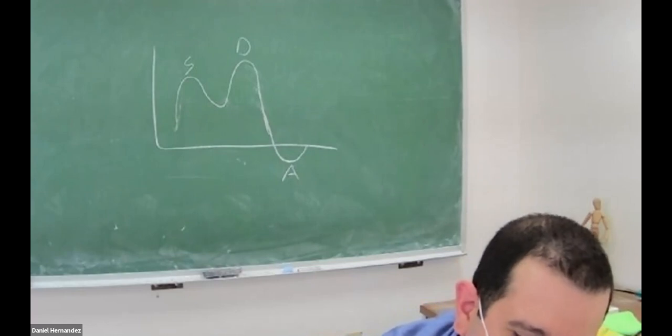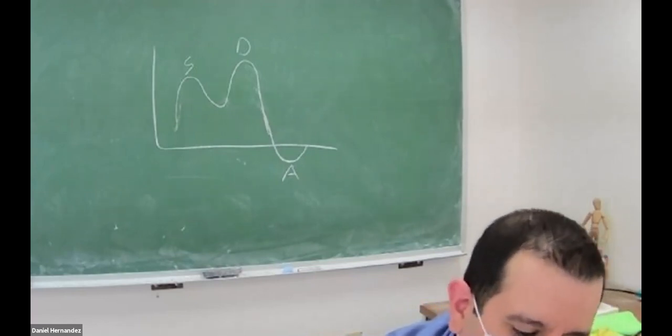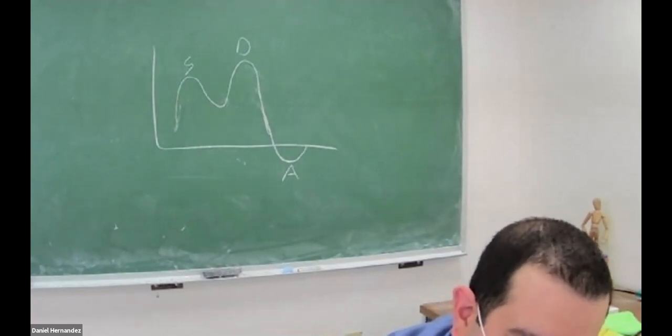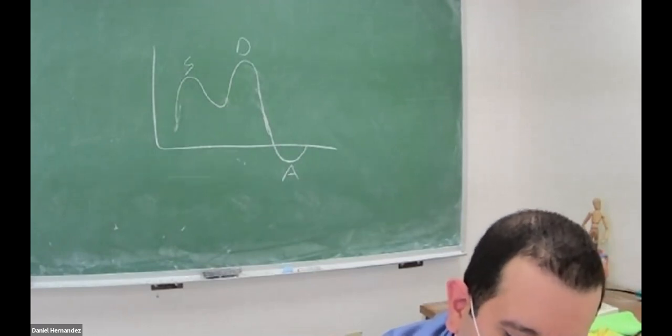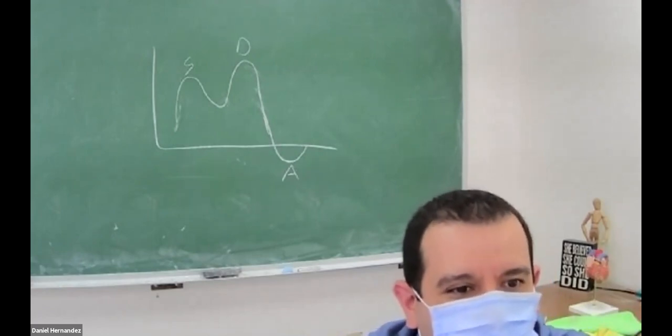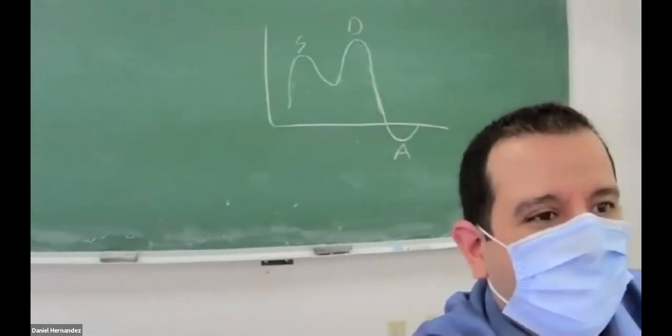Which pathology is a complication associated with complex aortic plaques? We have deep vein thrombosis, decreased ejection fraction, peripheral arterial embolism, pulmonary embolism. Peripheral embolism? Of course, aorta. You're like, duh. Well, if you think about aorta, it's not going to be anything with the lungs. It's not going to be pulmonary related.